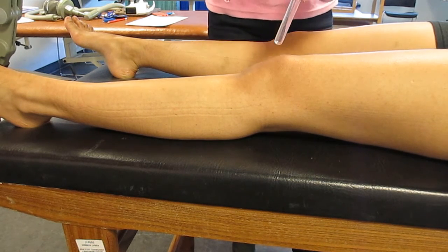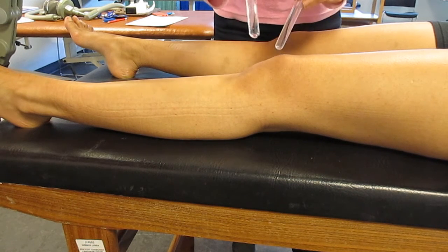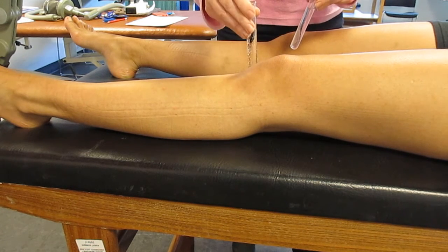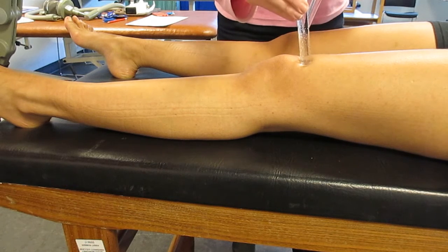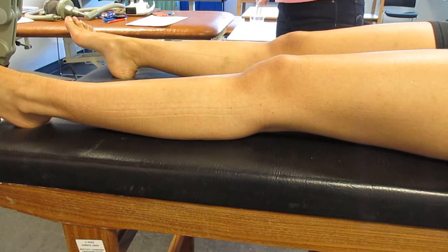So now I'm going to test them around your knee, so tell me without looking, close your eyes. It's hot, cold, cold, hot, cold, cold. Okay, thank you. So skin sensation is fine.